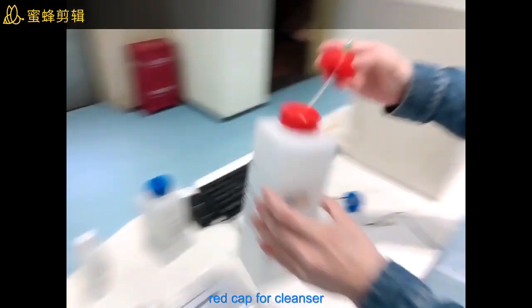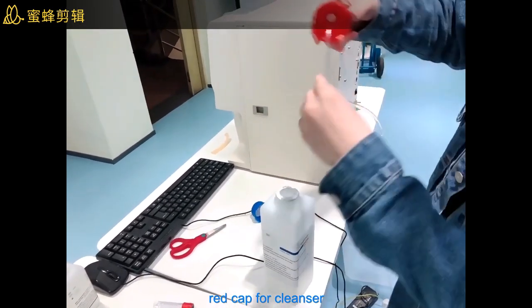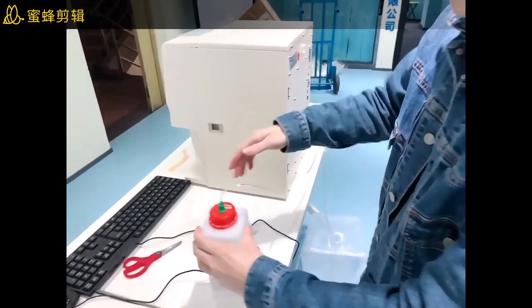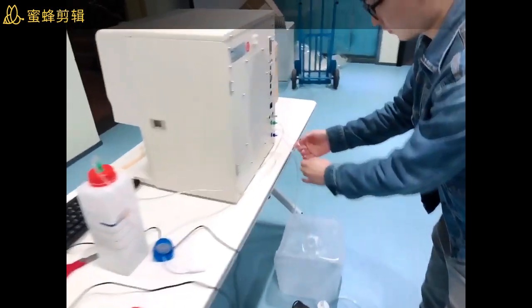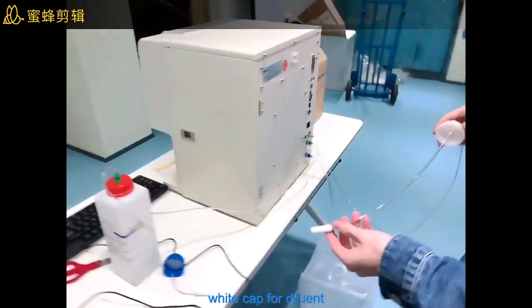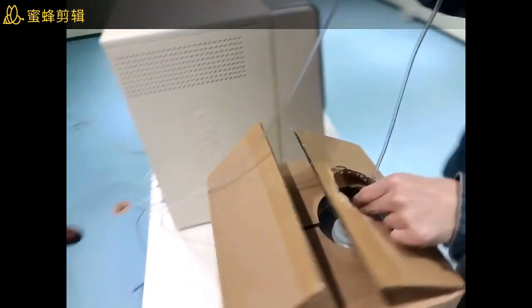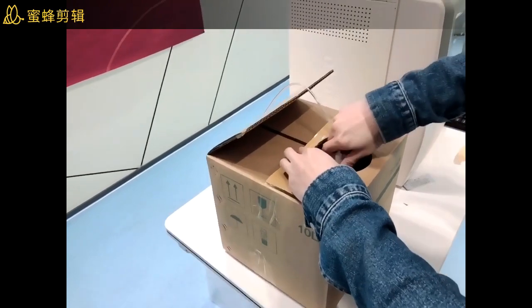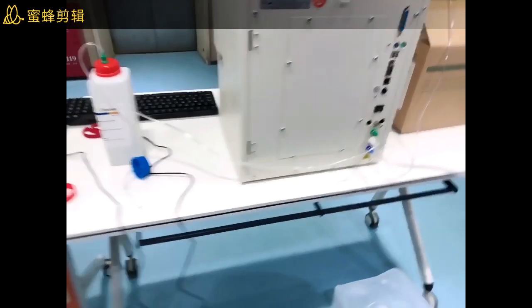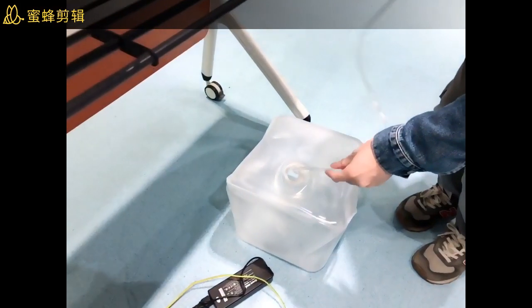The red tube is for the cleaner — you can open this bottle and put it inside. For the white color, you put in the diluent and place it here. The last one, the blue one, you put in for the waste.